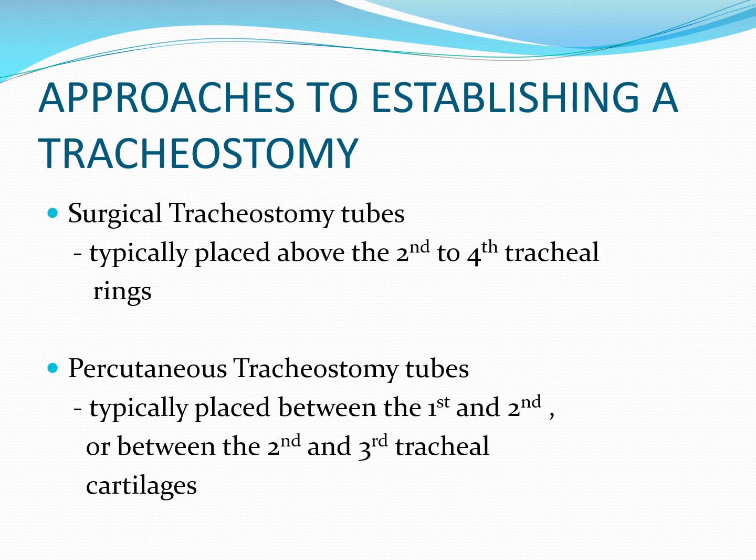And then there are catheters that are progressively larger that are put in that stoma in order to dilate it to the point whereby for an adult, a 6 or an 8 trach tube can be inserted in the patient. Much less common. So the percutaneous dilation method accounts for a few percent of the cases. And as I said earlier, the surgical method is by far the vast majority of the cases.